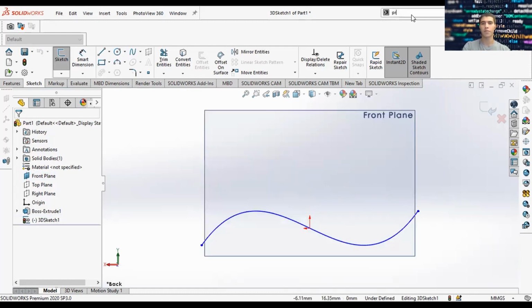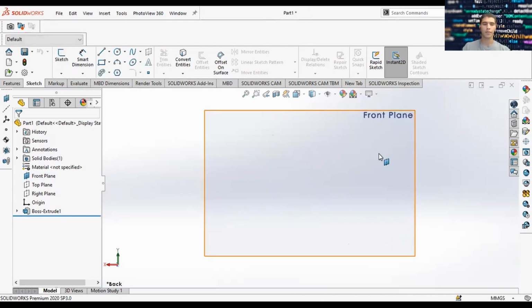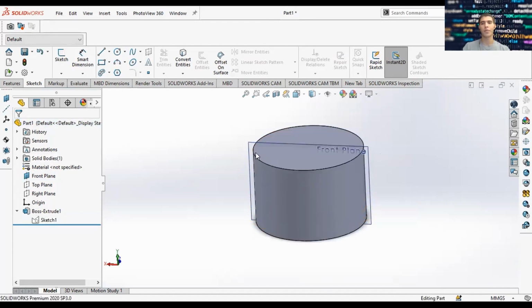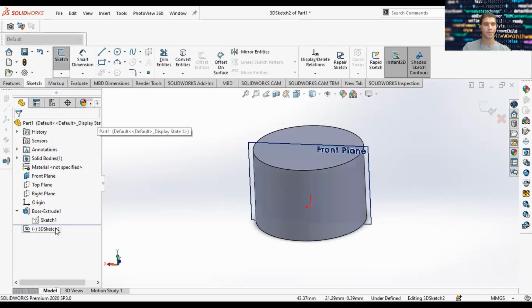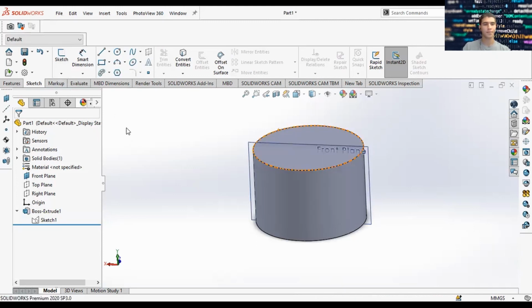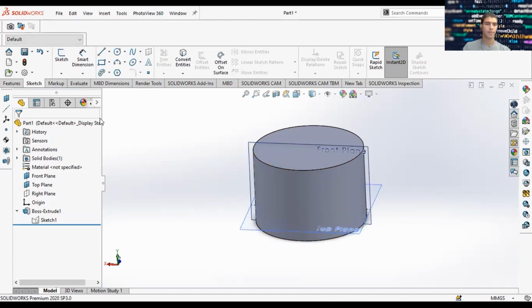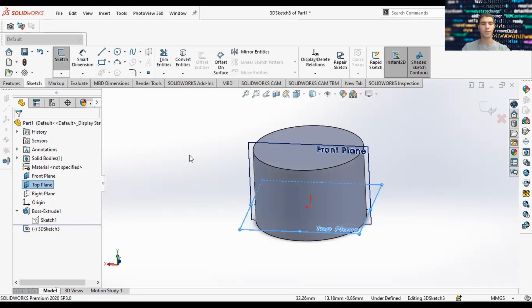Let me show you another trick you can use. Okay. You want to click OK on your sketches to approve it before you move on. Let's go ahead and repeat that in one moment. Select your top plane, you do 3D sketch, and then from there, you do equation-driven curve.